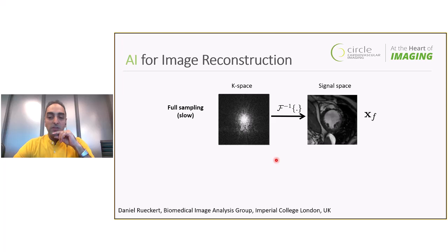And it is also important to note that this K-space information is not acquired in a single shot. It's actually very similar to how some digital cameras record images, in that they record it row by row. And the way this is being collected, it requires a lot of time. Thus, the patient needs to be inside the scanner for quite a long time while this whole K-space is reconstructed one line at a time. And in order to go from the K-space to an image, we apply a mathematical transform, which many of you might know is called the inverse Fourier transform. And once we apply that transform to the frequency space, we have reconstructed an image.